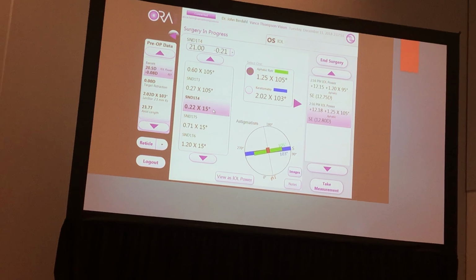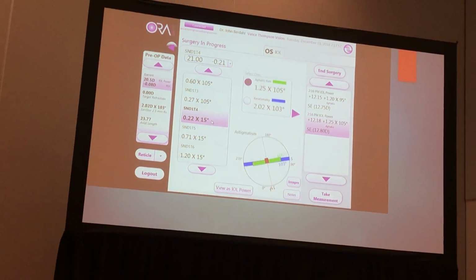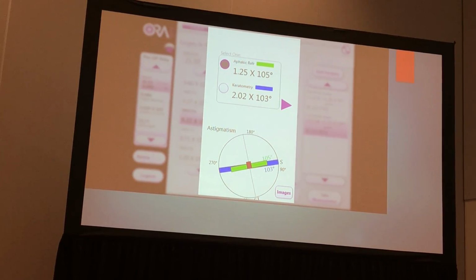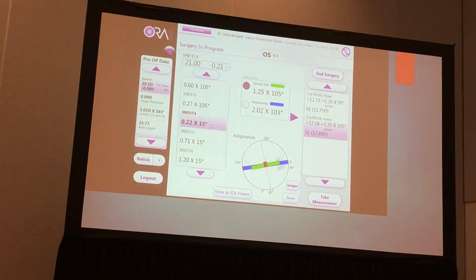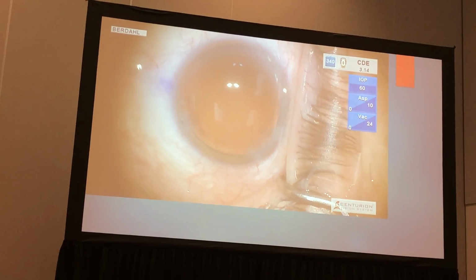The other thing that I really love Aura for is aligning toric lenses precisely. Our pre-op measurements suggested an axis of 103, Aura suggests an axis of 105 degrees, and I'm going to be able to put a reticle there that shows me exactly where 105 degrees is. And if you notice, we did have a 6 o'clock mark, but we don't even really use it because we go off of what the Aura measurement says.